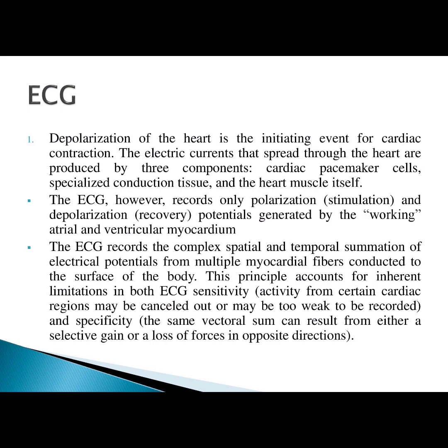This principle accounts for inherent limitations in both ECG sensitivity, as activity from certain cardiac regions may be cancelled out or may be too weak to be recorded, and specificity. The same vectoral sum can result from either a selective gain or a loss of force in opposite directions.